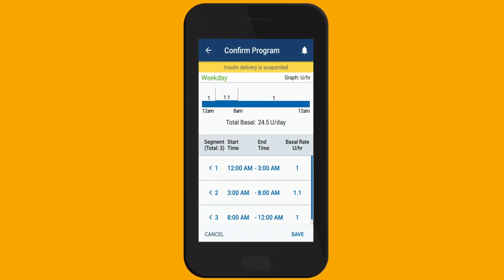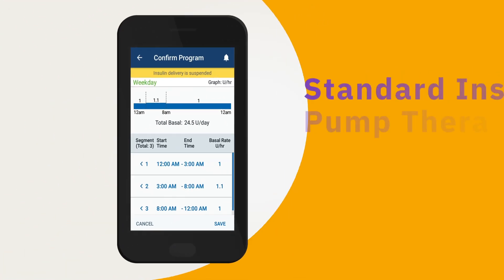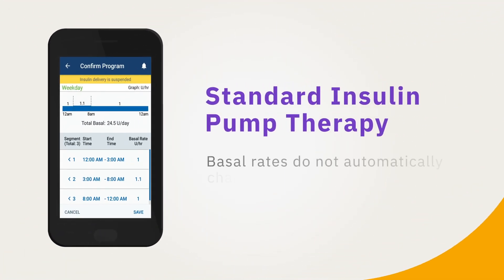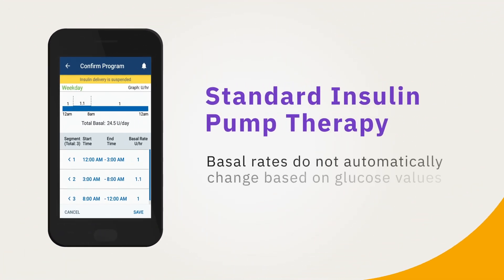Basal rates, measured in units per hour, can be customized to individual needs since there are likely times in a day when more or less insulin is needed. It is important to know that with standard insulin pump therapy, basal rates do not automatically change based on glucose values.